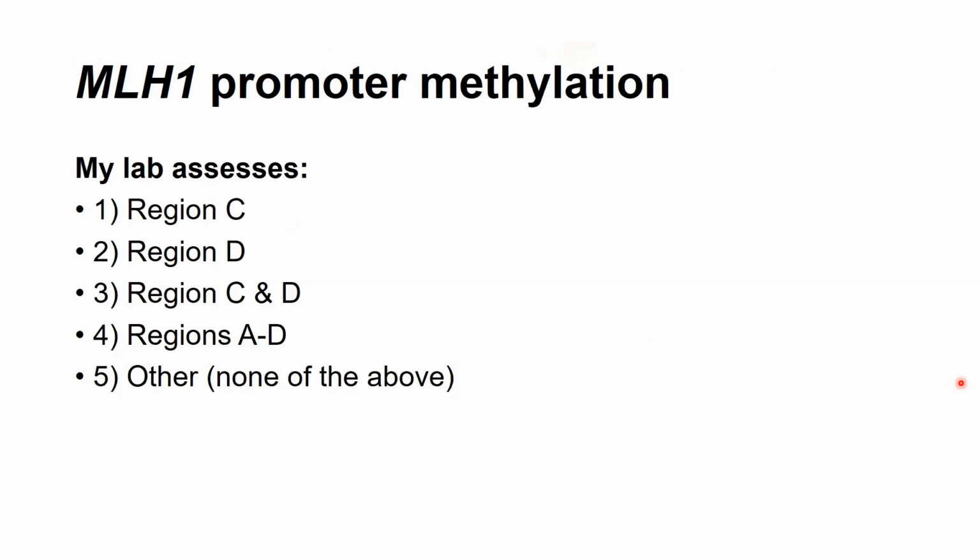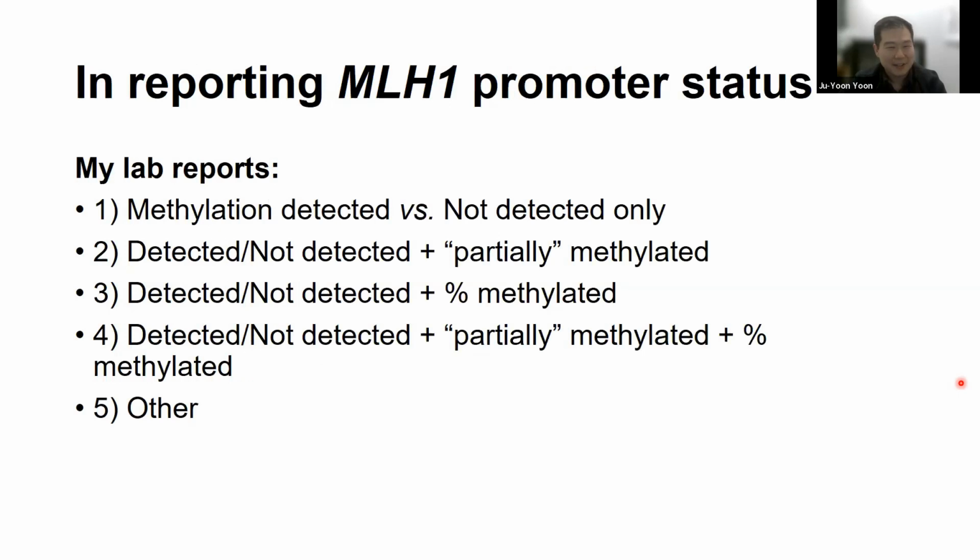Yeah. All right, so that's interesting. So generally speaking, I think a lot of labs report as detected or non-detected, but I'm curious whether people actually use this thing as quote unquote partially methylated and whether they report percent methylation.